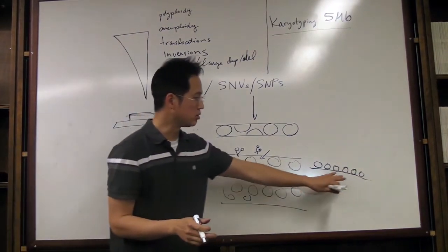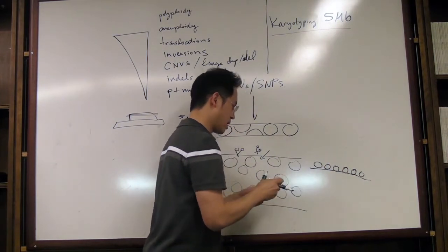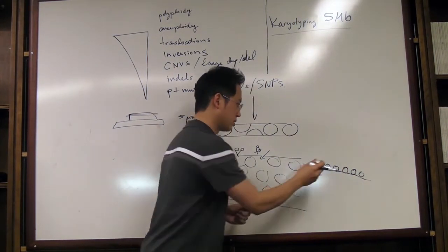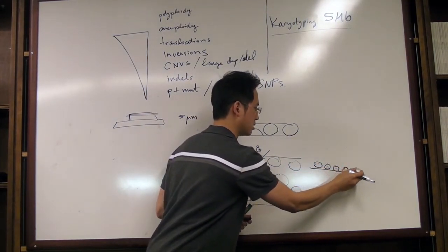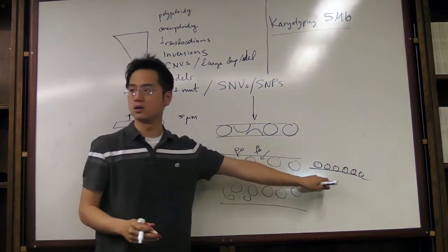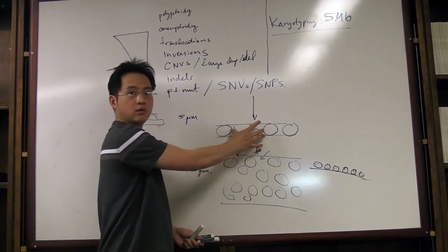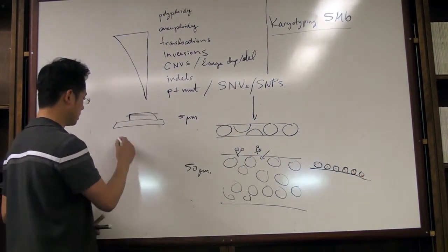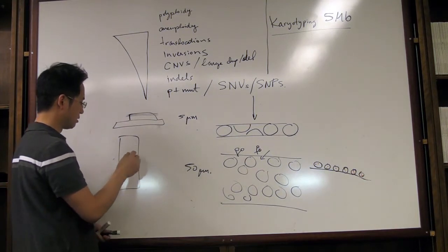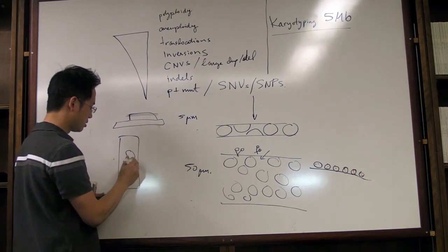So this is still going to be in situ because you're technically still probing the signals as they are in the cells. However, what you lose by using this technique is the very valuable information that we started out with, which is the tumor itself, right? So when we look at an H&E slide, like John or Valentina or I look at it, we know that, for example, there's tumor here.